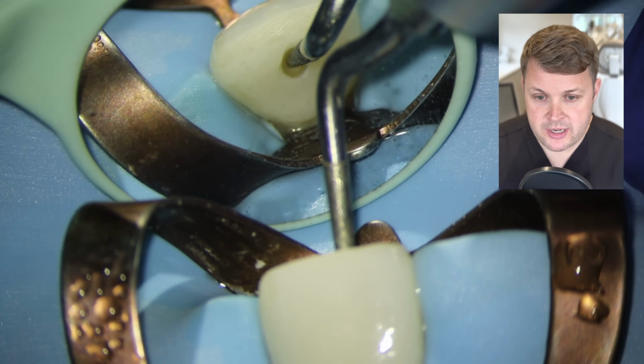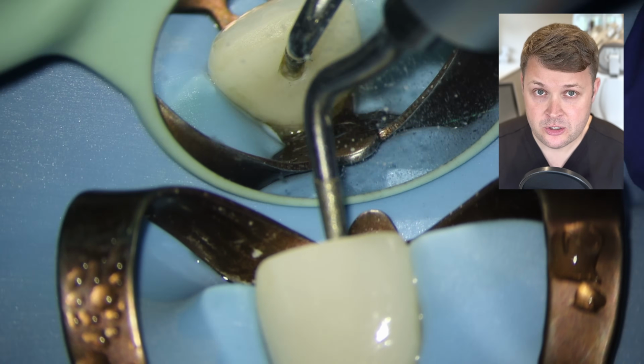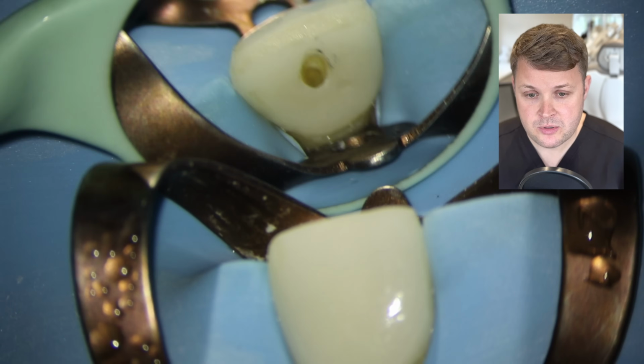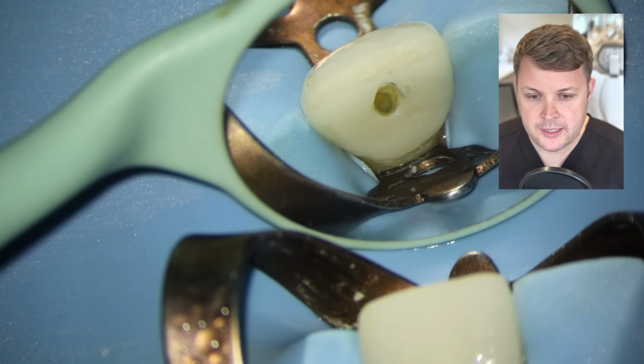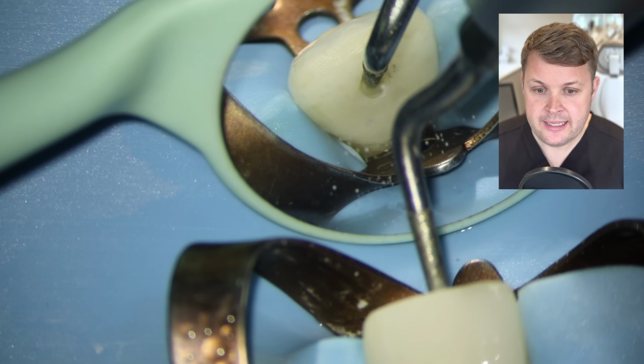So what I'm going to do straight away is use some ultrasonics here. So this is a dedicated endodontic ultrasonic unit with the tips diamond coated, and you can see here that it opens up the canal, but it still needs a little bit more refinement essentially, and you want to use these really judiciously.